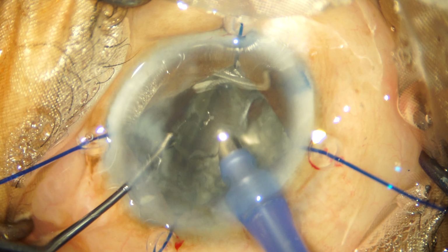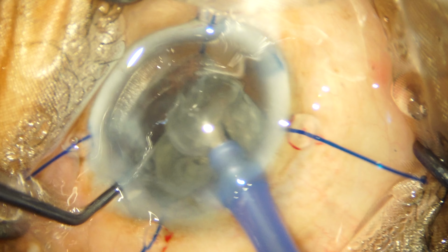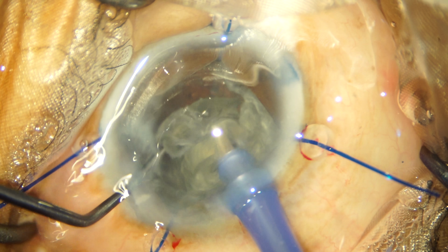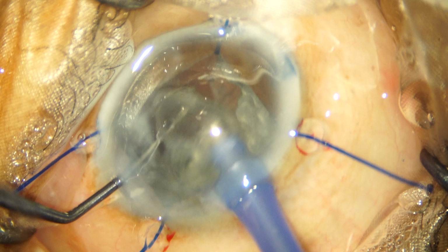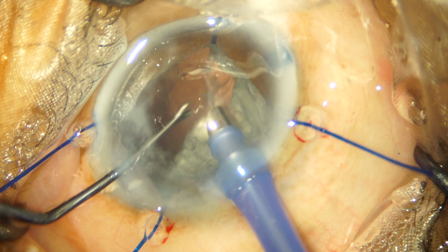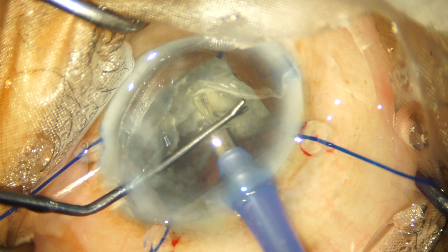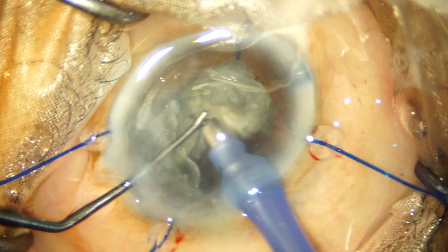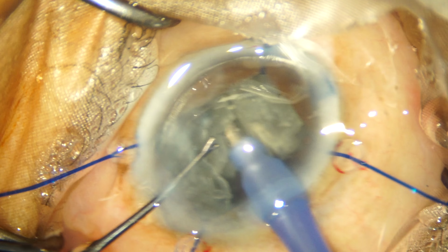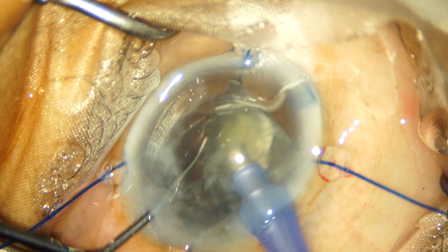You will notice that I'm being a little overcautious and I'm emulsifying the nuclear fragments very slowly. I'm a right-handed surgeon who's used to sitting superiorly when operating. And this case has numerous factors which have put me out of my comfort zone. Firstly, this is the left eye, which is a very deep-seated eye and has a prominent brow and a very large nose. So I have to change my position to a superior temporal position.